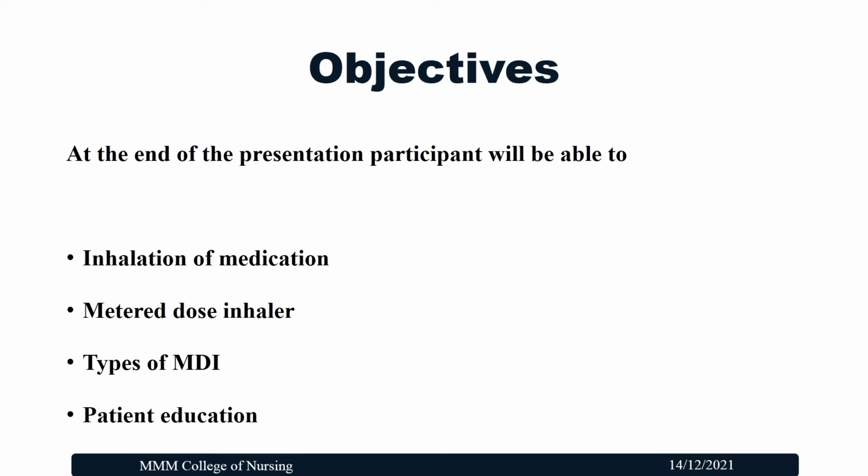In this session we are going to learn about the inhalation of medication and the metered dose inhaler, its different types, and the patient education related to the usage of it.